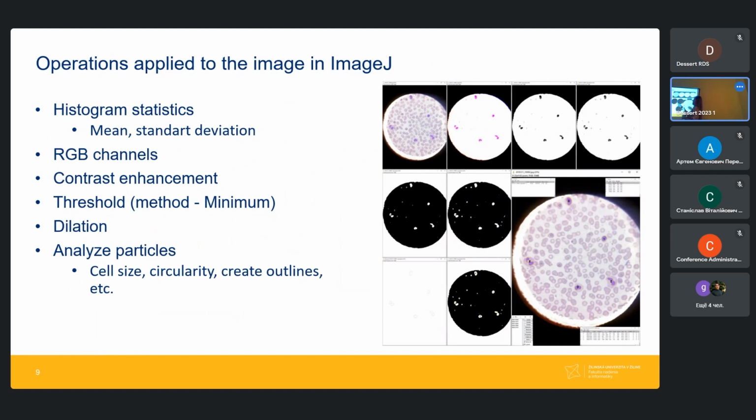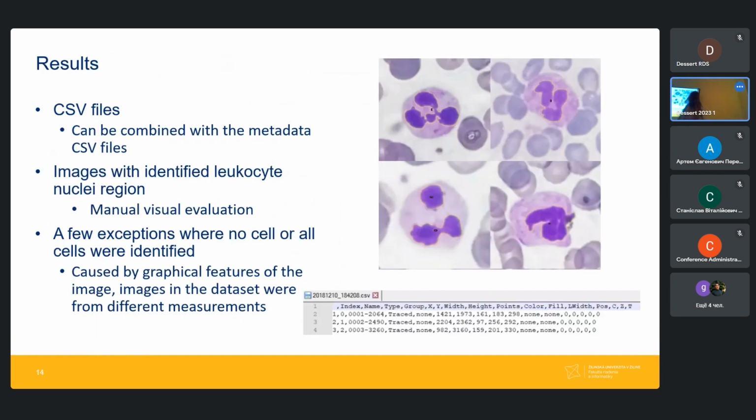It's also a process for image segmentation, and it works like this: let's say you have this very thin area. In image segmentation, it can often happen that these things just separate, like here.